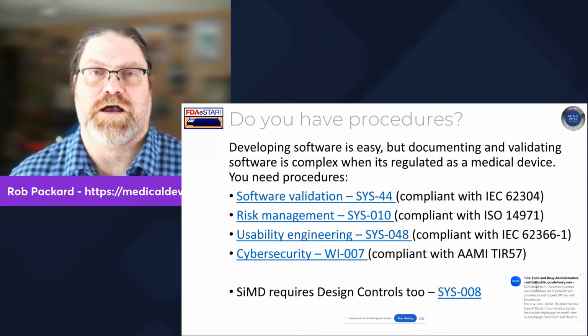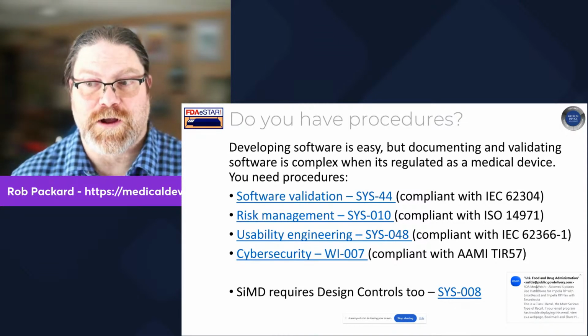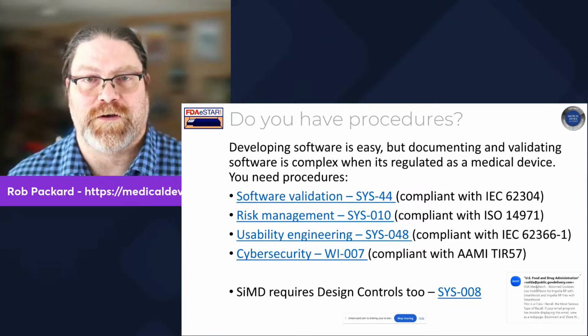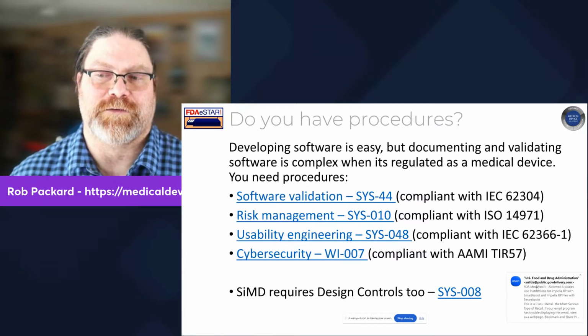Build yourself a design history file with a good foundation. That's how I describe this. These four are your foundation. And if you don't have the foundation, you're building your entire company on the beach with no foundation at all, and it's going to collapse as soon as you try to put it in front of the FDA.